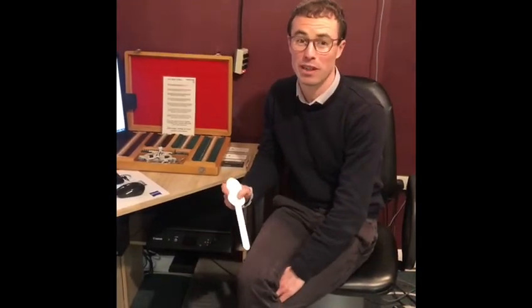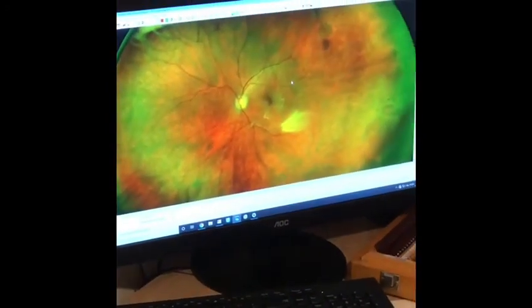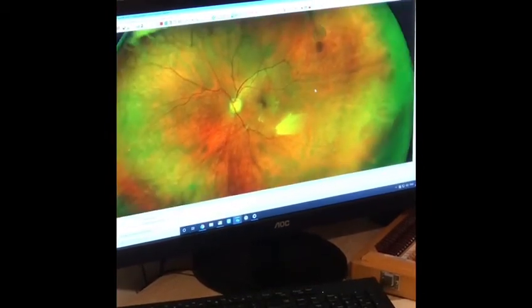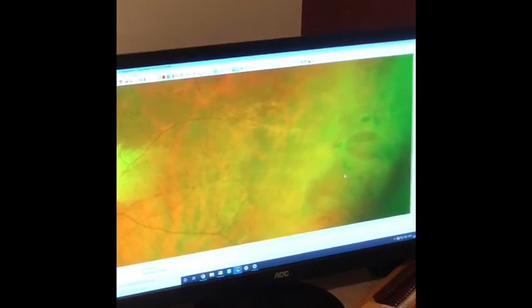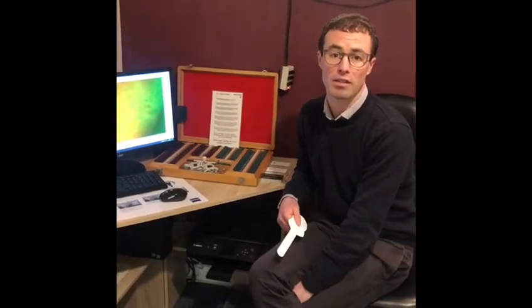One real-life example of how the Optomap works really well is this photograph here. This gentleman came in without any real symptoms, just a normal routine sight test, and at first glance it looks like a fairly normal, healthy photograph, healthy retina. But if we do zoom in and work ourselves to the outside, the temporal retina, we see a suspected retinal tear here. I referred this gentleman on to the eye clinic at Wrexham and just spoke to him this morning, and he's had laser treatment to seal this tear, which will hopefully prevent it from developing into a retinal detachment. So yeah, a perfect example of how the Optomap can save sight.